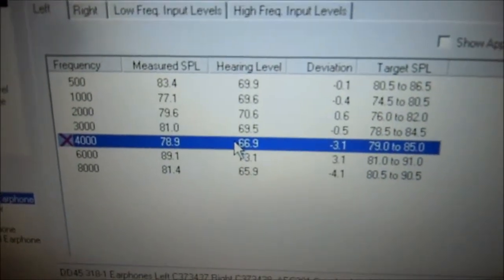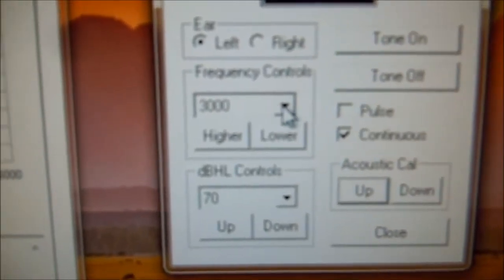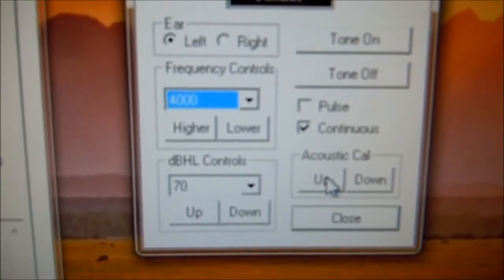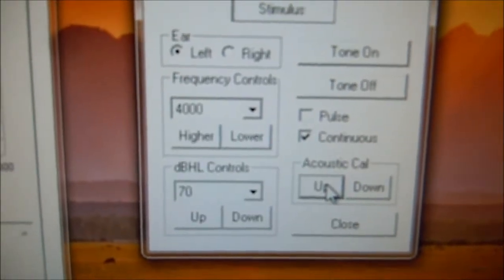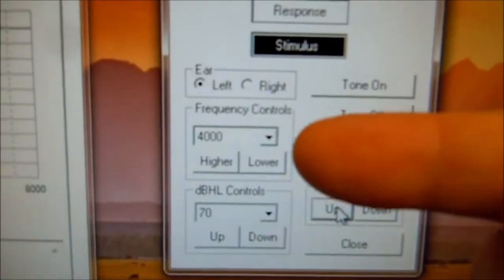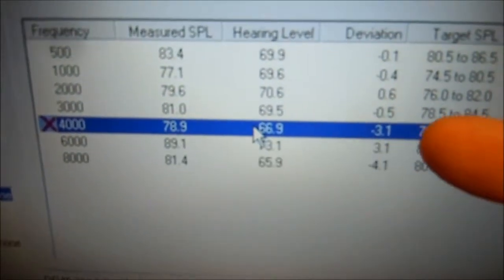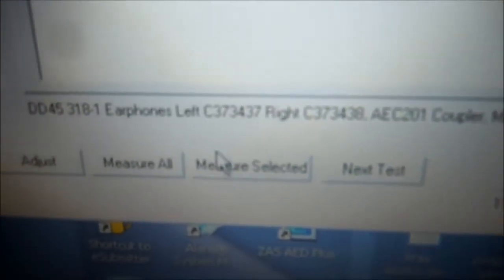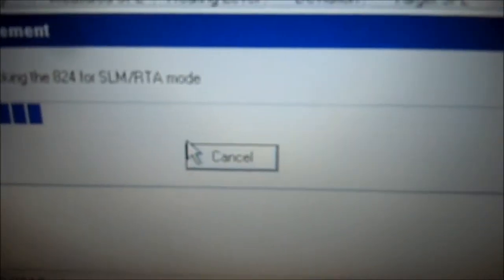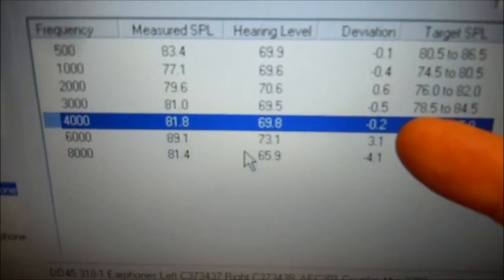Now we're going to select 4,000 Hz, which is a negative 3, so that means we're going to go up 3 — 1, 2, 3. Come back over here, select 4,000 Hz and because it was negative 3, we're going to go up 3 clicks: 1, 2, 3. Don't worry if you didn't see the button get selected — listen for the clicks, you want to hear 3 clicks. At 4,000 Hz, 70 dB, tone's on. Come back to audit software, make sure 4,000 is selected. It's at negative 3. We're going to click measure selected. It's going to ask us 70 dB at 4,000 Hz — hit OK. And now that red X is gone and we've brought it closer to zero, which is negative 0.2.